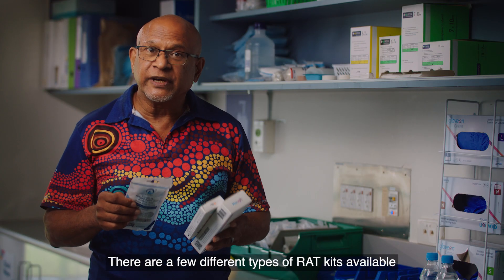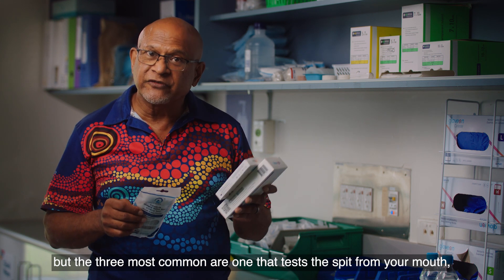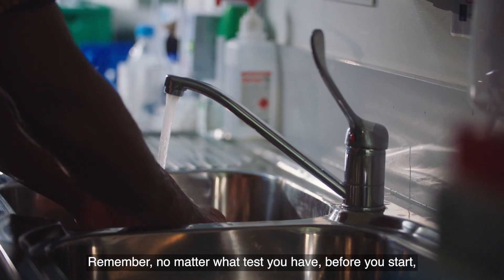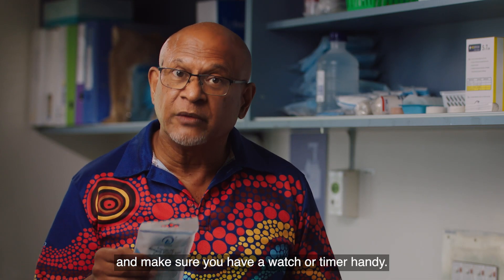There are a few different types of RAT kits available, but the three most common are one that tests the spit from your mouth, one that you suck like a lollipop, and one that takes a sample from your nose. No matter what test you have, before you start, wash your hands and make sure you have a watch or timer handy.